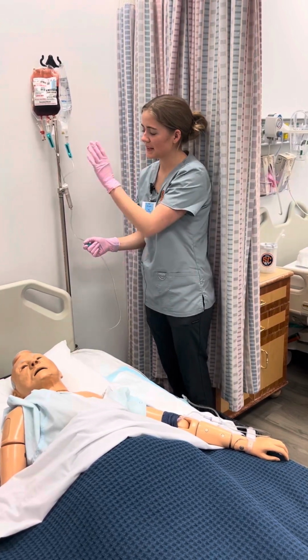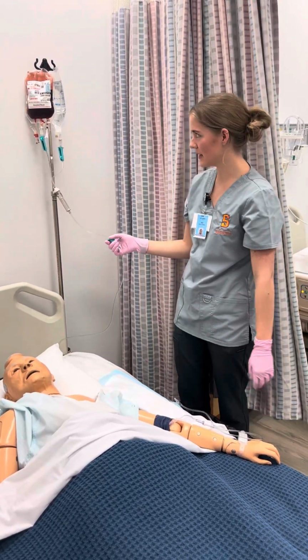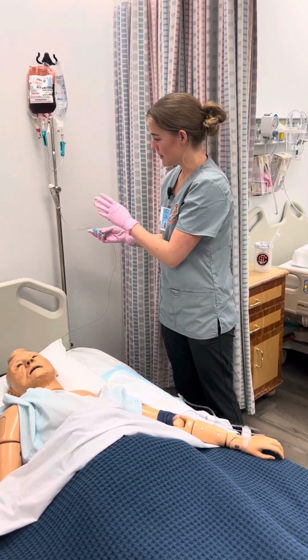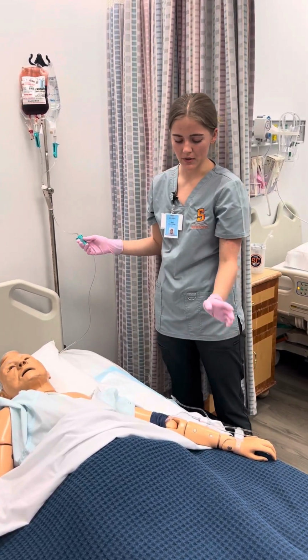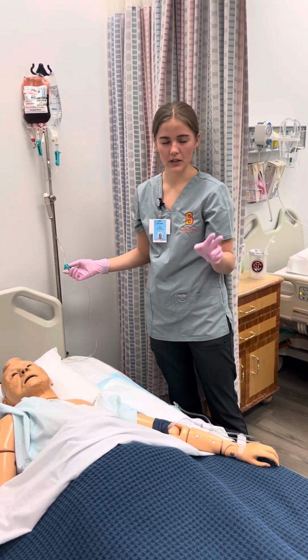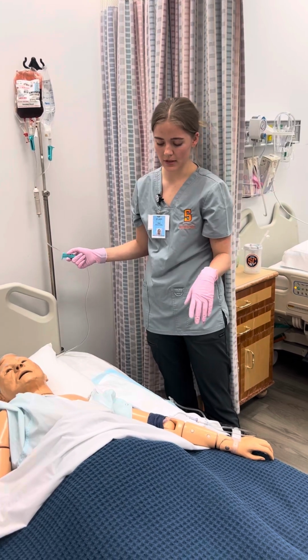Okay, well, we're just gonna assume that the blood is going because apparently my tubing's not long enough to reach it. But as soon as it's go, I'm gonna let this run to my patient and I'm gonna slow it down and make sure that it's going at 2 mils per minute for the first 15 minutes.